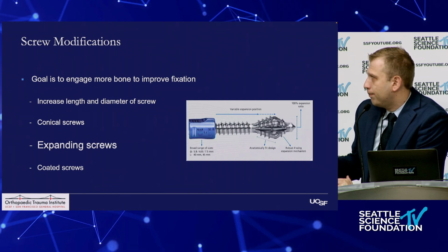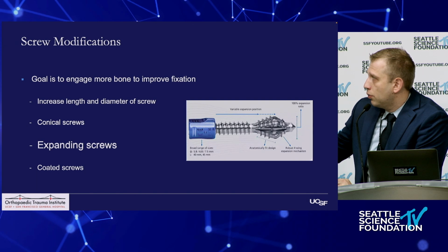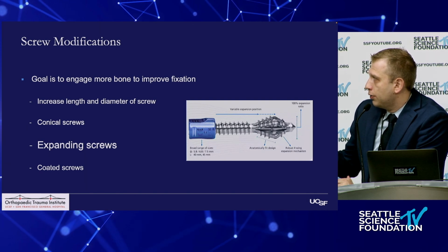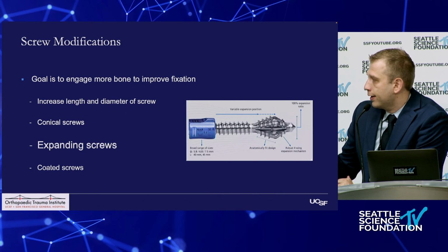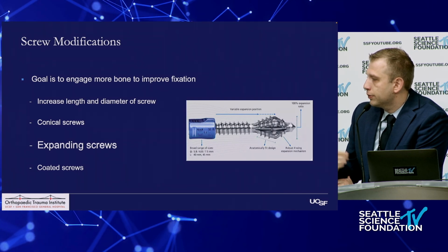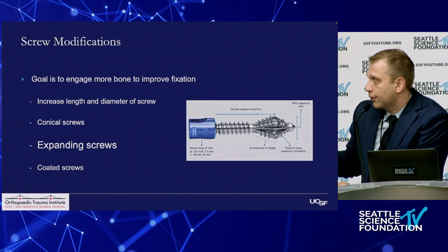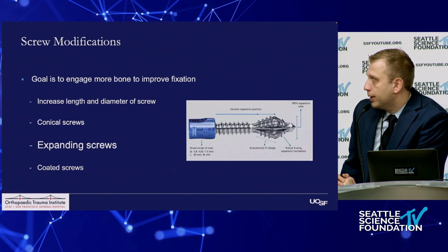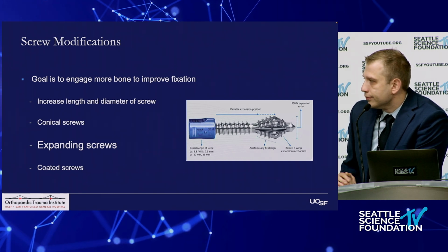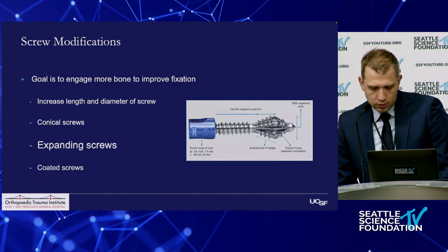But also another thing that people don't really talk about is when you expand that area, you actually shorten the contact area a little bit, and so you lose a bit of your functional length with the bone, which I think the argument is you make up with the increased diameter of the screw, but that's still some fixation that is lost.